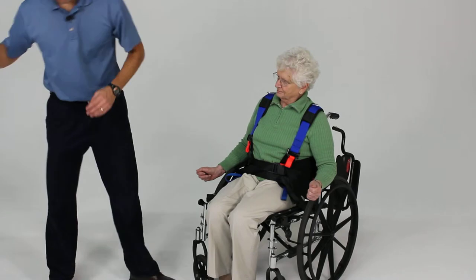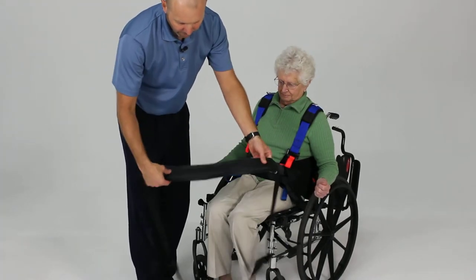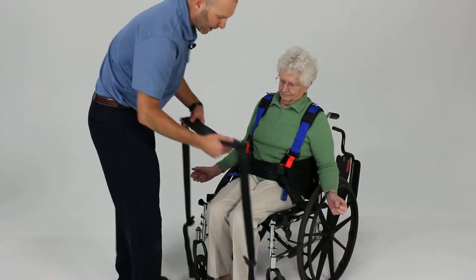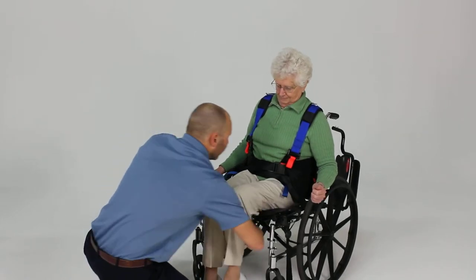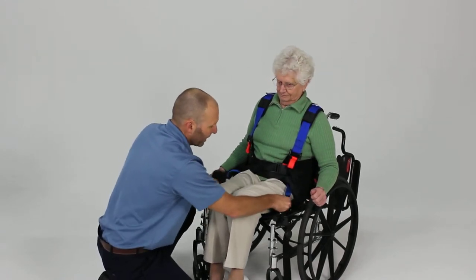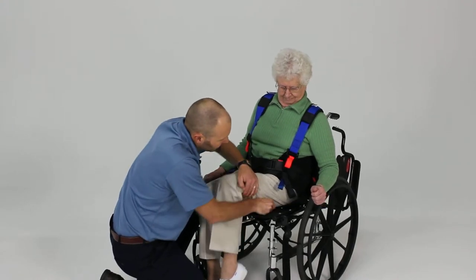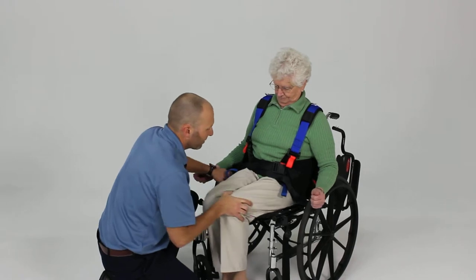We're going to take our lower gluteal fold strap, which has a rubberized surface, and place it just underneath their gluteal fold. We'll place it underneath the legs and slide it, working our way up underneath the person's hips as far as we can. If needed, you can have them lean to the side a little bit so you can really tuck that up as far as you can comfortably underneath their hips.